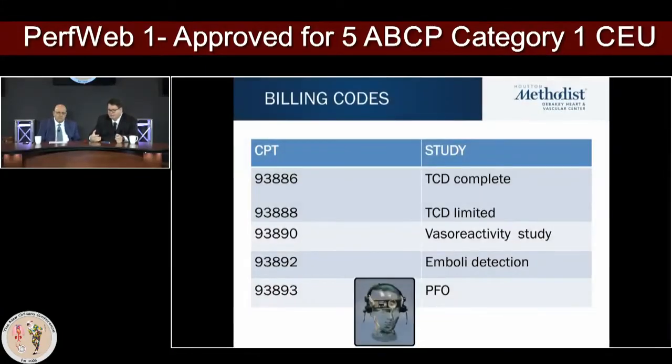And the TCD, again, is not an investigational device. These are the billing codes associated with a TCD, and this has been in place since 2005, so this is not like last year. I don't want to comment on reimbursement and how it changes, but each state has different reimbursement rules.